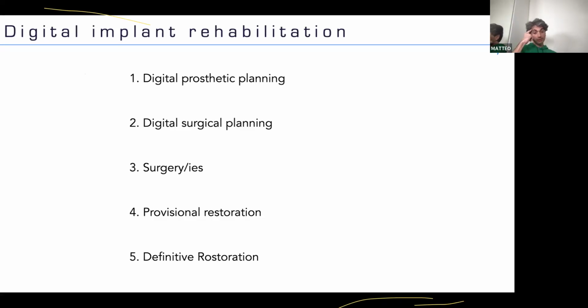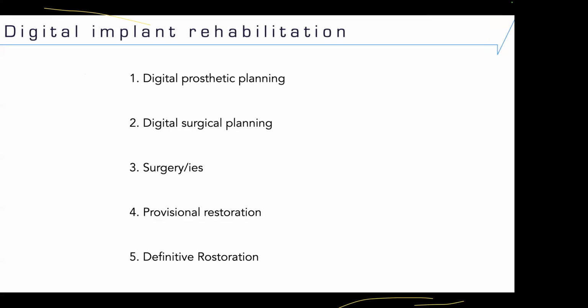We do the surgery or surgeries, and we put the provisional restoration that could be at the same time doing an immediate loading procedure or waiting a couple of months, and then we do the definitive restoration. Okay.